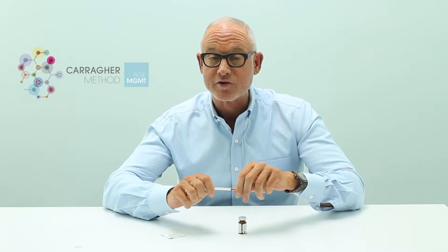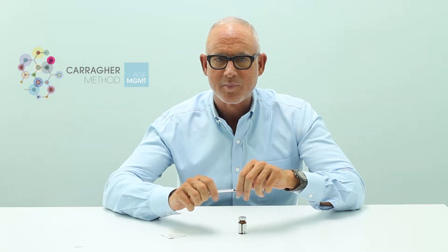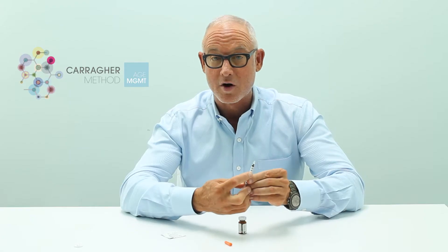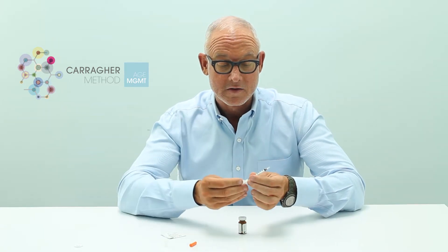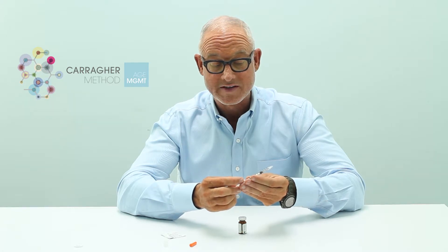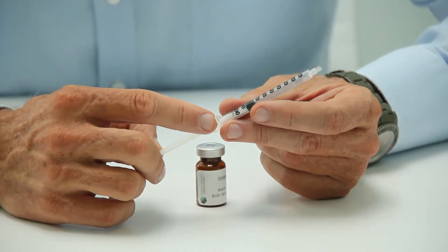Depending upon your dosage of the medication, if your dosage is to inject 0.3 ml, then that's going to be to the three mark on the insulin syringe — or the 30 mark. That's where you're going to want to draw up to when it comes to the medication. Or if you're at 0.75, you're going to go to between the 0.7 and the 0.8 mark. It's pretty clear.